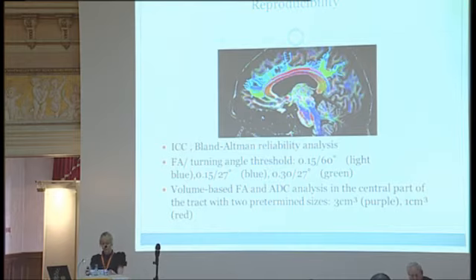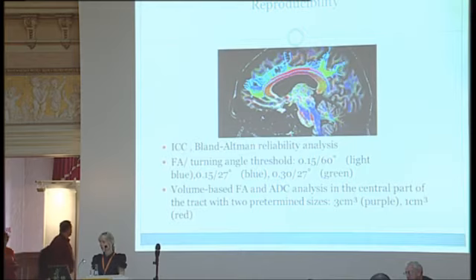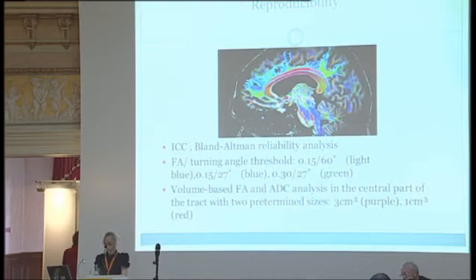I shortly introduce some additional reproducibility results that have not yet been published except in my dissertation, which had public defense a few weeks ago. In this reproducibility study, inter-rater and intra-rater reliabilities were assessed by both the intraclass correlation coefficients and Bland-Altman reliability analysis.